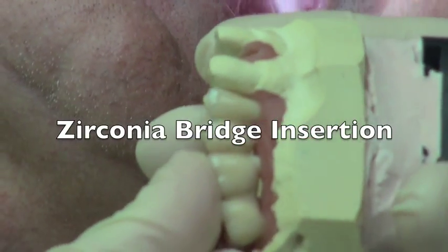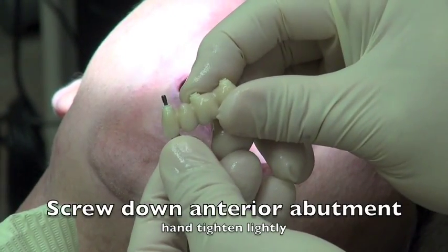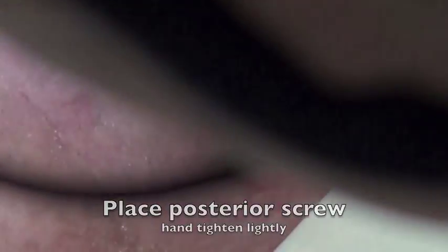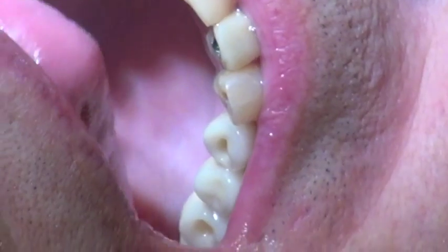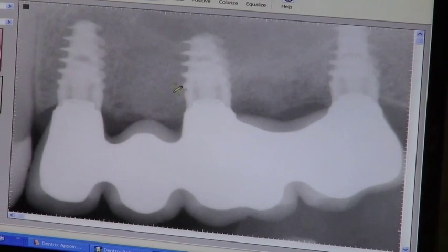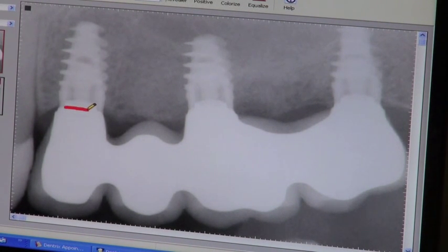We're going to insert the bridge now. We go back to the patient, take it off the model, and start trying it in the patient's mouth. Because the patient has had healing abutments on, it's going to create a little pressure when we insert it — usually the patient feels it for about a minute and generally doesn't need to be frozen. You'll see some blanching of the tissues as we tighten down. I'll place the middle screw, then the posterior screw in a sequential format, then take an x-ray. Looking at the x-ray, you can see right across the interface that the bone is staying to the very top of the implants when using this staged healing approach — the bone grafting material stayed nicely, which looks very favorable.